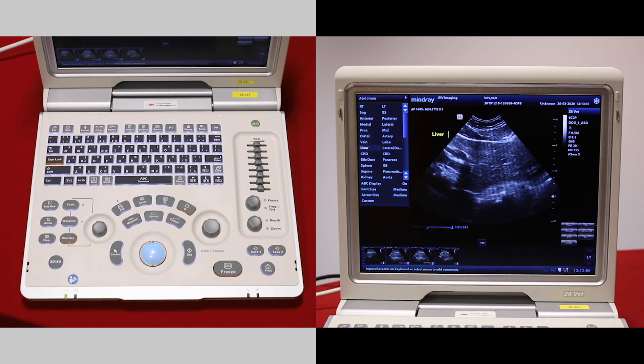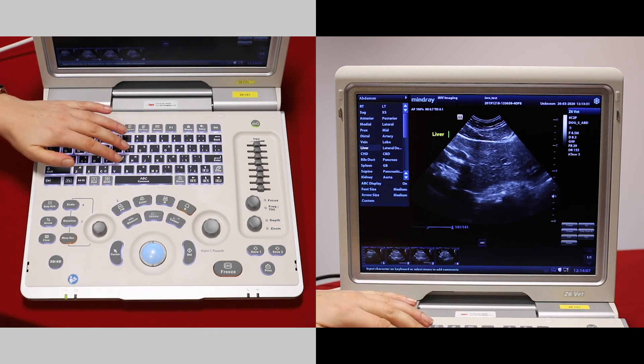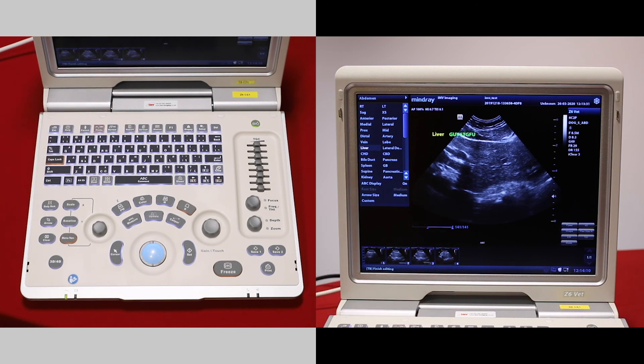Save to save that. Alternatively, once you've pressed comment, you can just free type on the screen and save to save that comment.